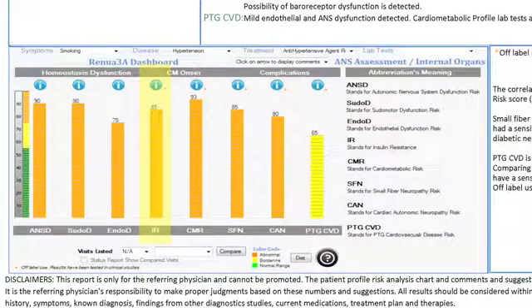The next measurement is IR, or insulin resistance risk factor. This measurement shows the chances of a patient having or developing insulin resistance. If a patient who has borderline blood sugar is borderline obese, and you're not sure whether you should tell them they are insulin resistant, this graph will help direct you in one way or another.